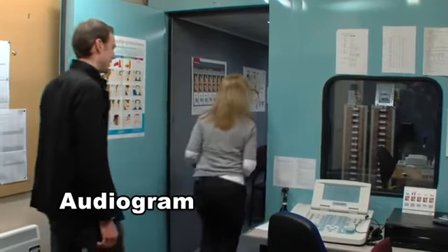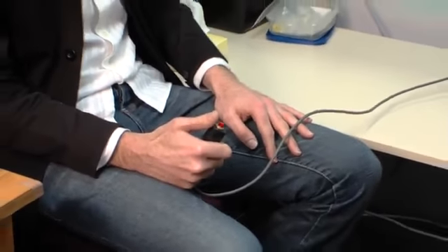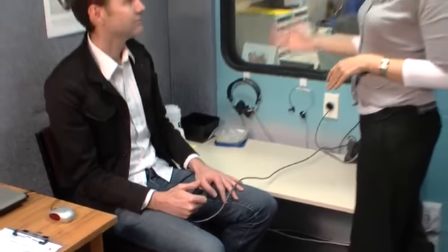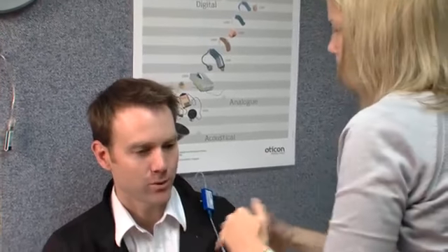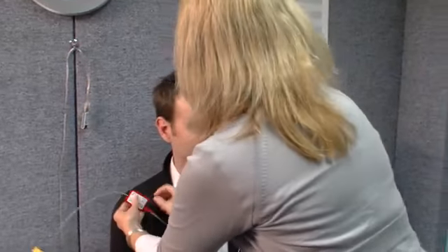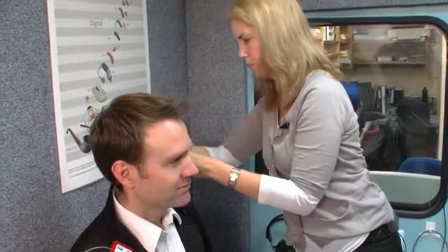Now for the audiogram. Here we go, just have a seat there. So I'll just give you that button there. What's going to happen is I'm going to put some headphones in your ears and you'll hear beeps in one ear at a time. Whenever you hear a beep, you're just going to press that red button, even if it's very soft. Okay? I'm just going to put these in your ears. These are right clipped onto your jacket here? Yeah, sure. So it just sort of goes in your ear like a foam earplug.